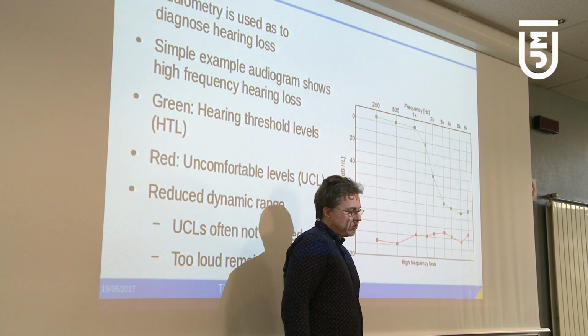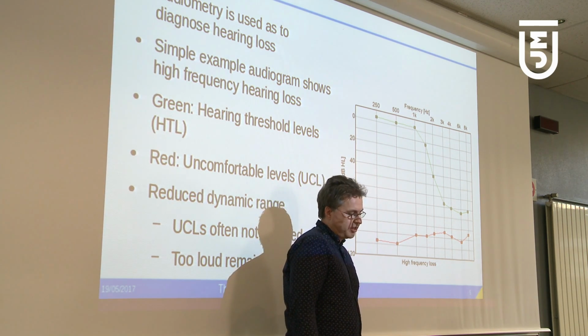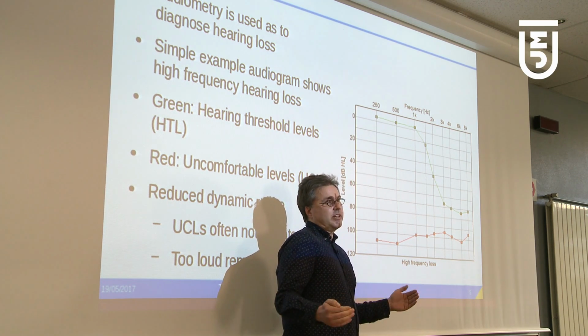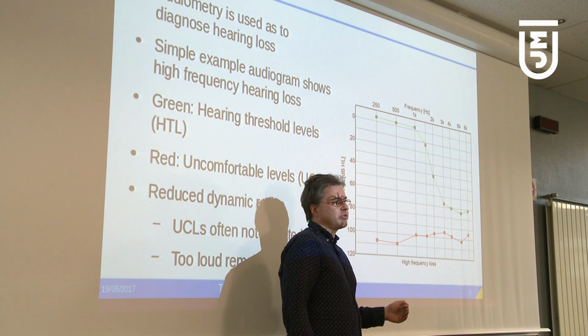When you want to diagnose if someone has a hearing loss, you usually do audiometry. Audiometry means you play that person soft sinusoid sounds and ask them at what level they actually hear something. And you determine what is normal by getting an ensemble of people who will probably hear normally and then measure their hearing thresholds.